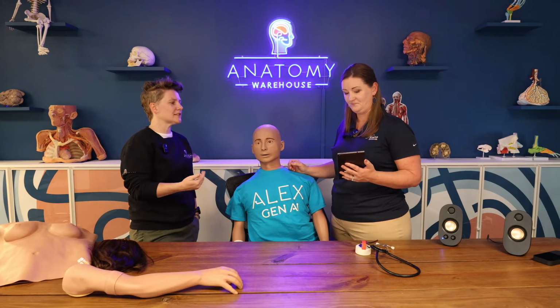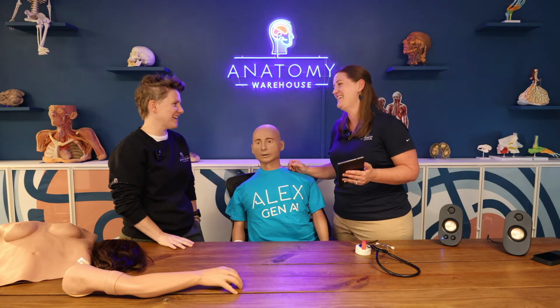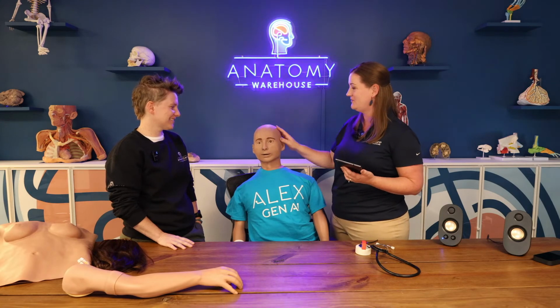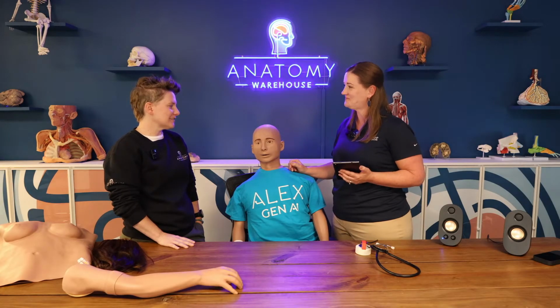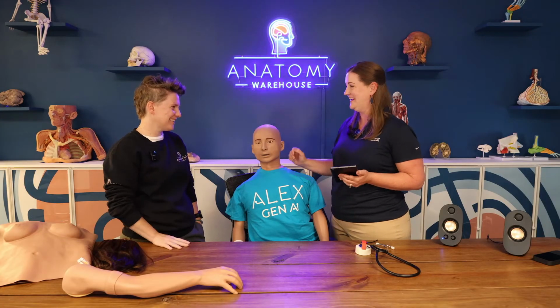Well, how about you leave the tablet with me and then you take Alex home and we can talk to each other through Alex. We could do that. We could just have a conversation. I could sit and stare and look at him. I'll put his hair on because I mean you've got some hair. We got to put some hair on him. Hair, no hair. I think it would be fun to use Alex as like a teleportation device to talk to you more often. I'd love that. I'd love that.